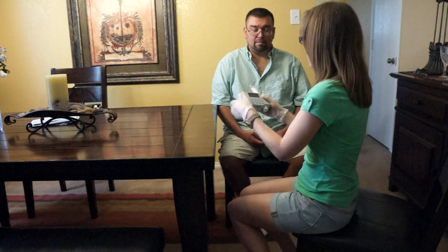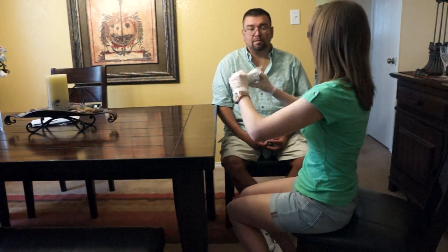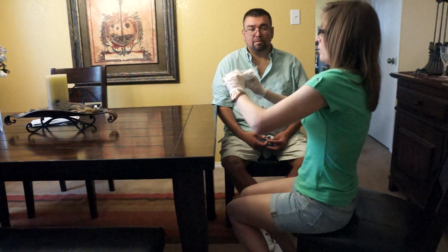Okay. So when we're ready, I'm going to hand this to you. You're going to hold it just like a hamburger, okay? You're going to take a big deep breath in, put your mouth around it, tongue underneath, good tight seal first, and blast out as hard and fast as you can, almost like you're blowing out a million candles on a cake, okay? In one breath.